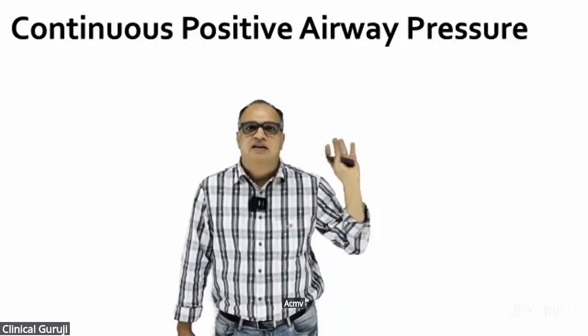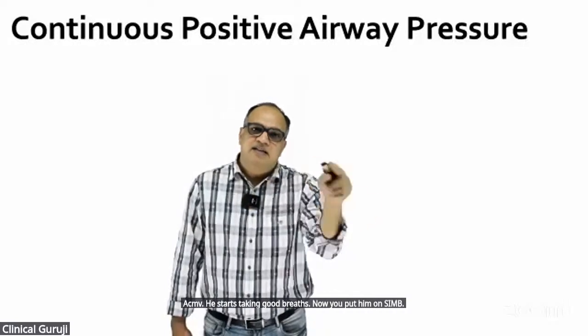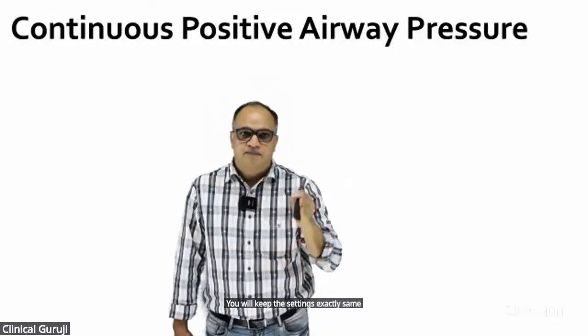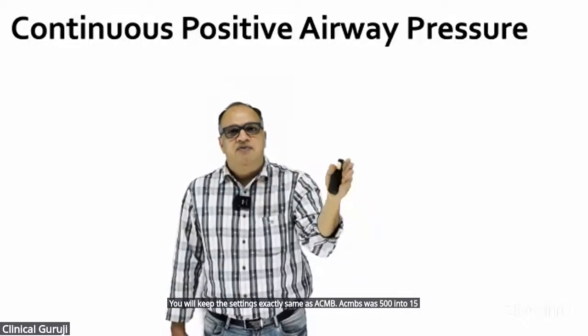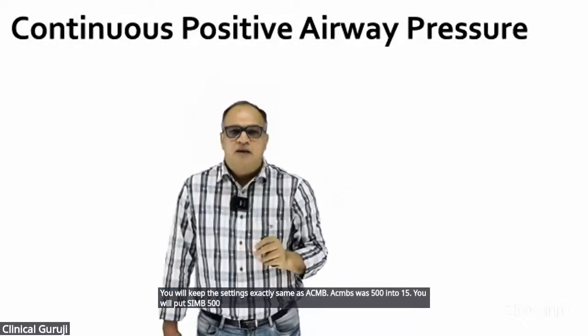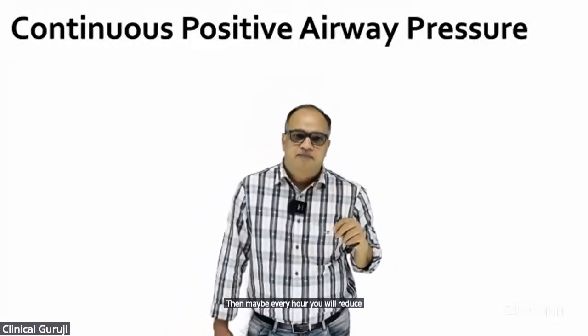He starts taking good breaths. Now you put him on SIMV. You will keep the settings exactly same as ACMV. ACMV was 500 into 15. You will put SIMV 500 into 15. Then maybe every hour you will reduce 2 breaths in SIMV.